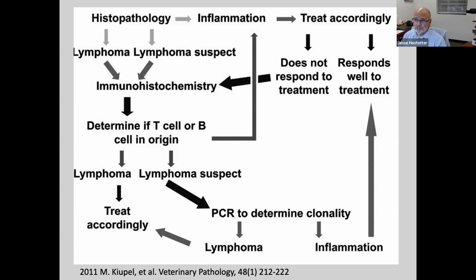Now, that begs the question: am I interpreting it correctly? And is there inflammation that's mild and I'm missing? But I don't try to decide if it's in the outer third. Maybe that's something I'll keep looking at, but it's a very good question. I don't want to discount their observations or their thoughts on that. It may be true, but I typically don't do that.